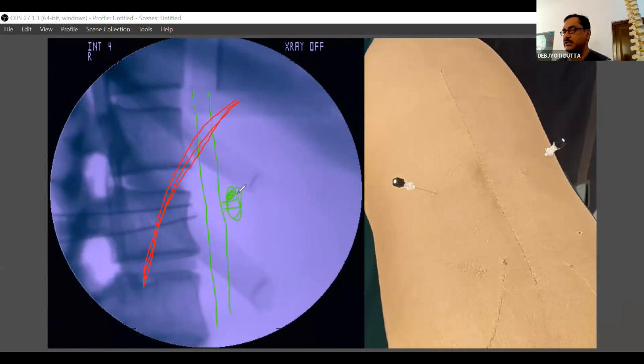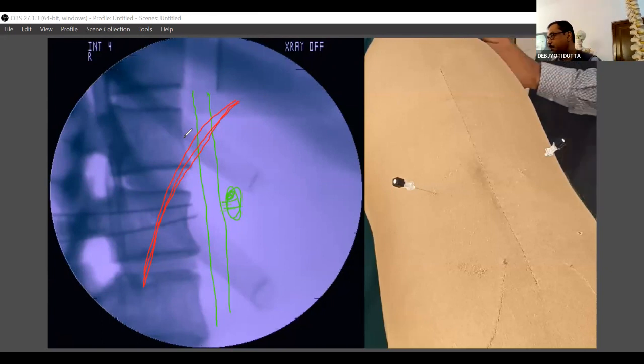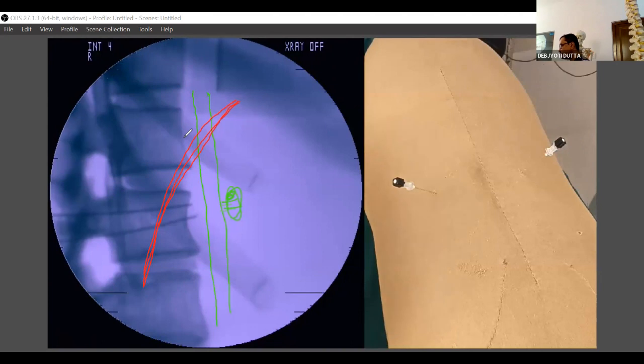Right? I'm keeping this needle in position. So now I'll be showing you the retrocrural. For retrocrural, it should be along the 12th rib, and it should come posterior to the crura. Exactly the same, but instead of the level of L1, we should be at the level of T12, and we again give a large volume, expecting that it will be coming towards your aorta.